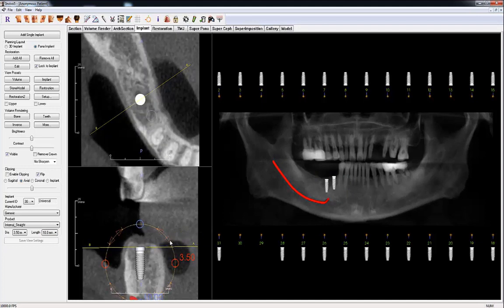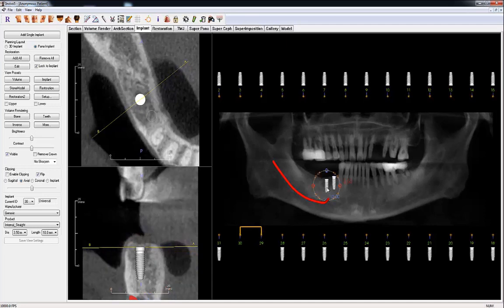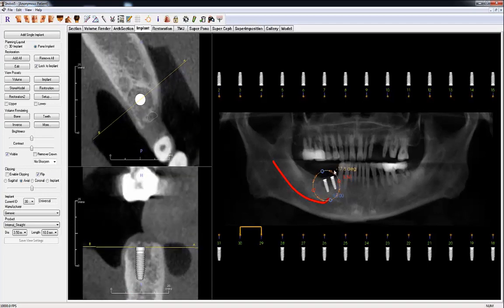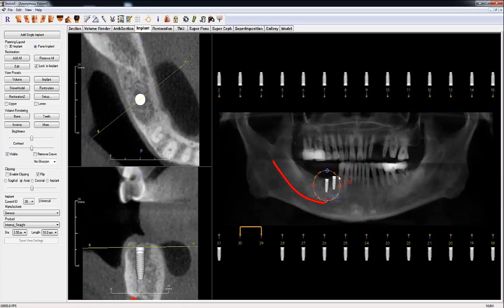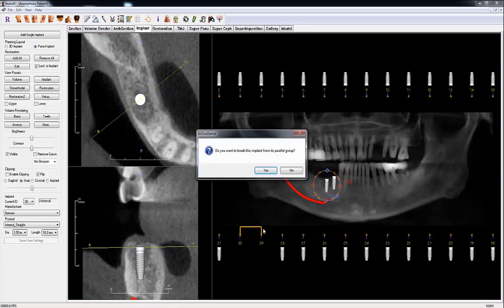In the panel view, you have the option of making implants parallel. Click on the node at the head of the implant and drag to the node of the other implant you want to make parallel. When you select an implant, the other implant will become parallel to the selected implant. If you rotate one implant, the other will also rotate accordingly. To remove an implant from the parallel group, click the node of the implant and choose Yes.